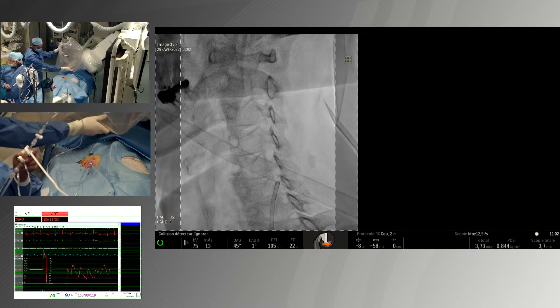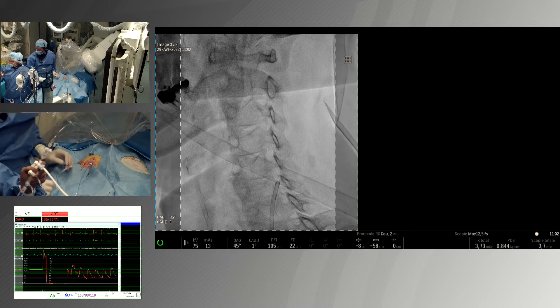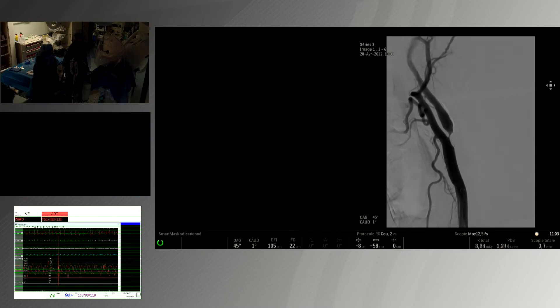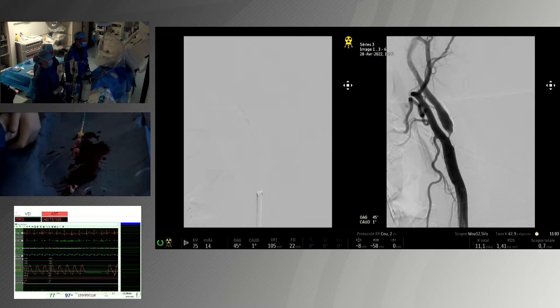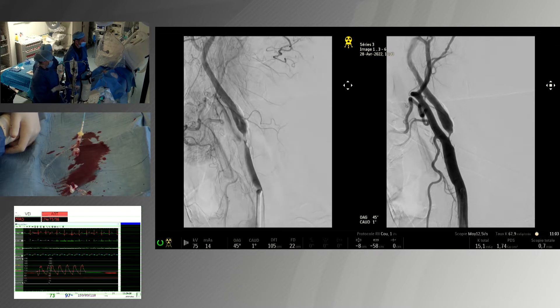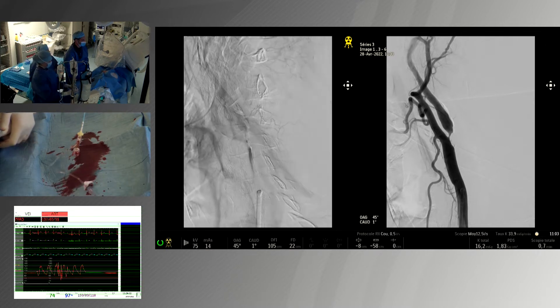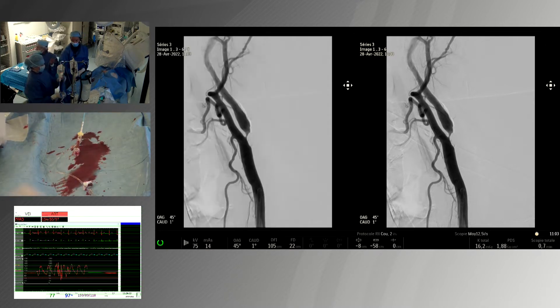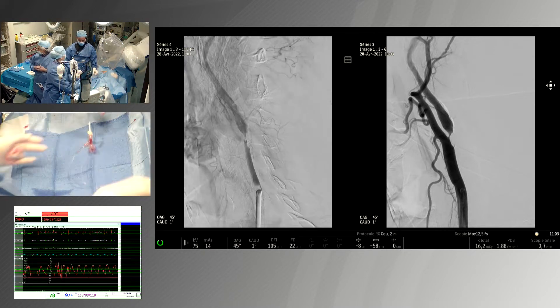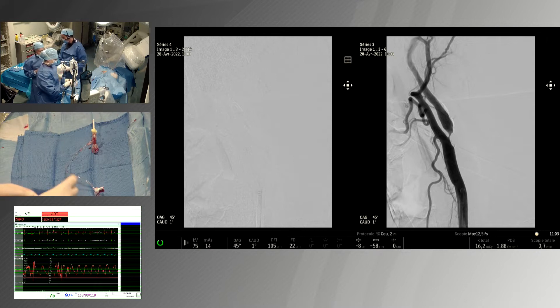We have installed the manual system and we are going to check the lesion now. You can see it's a very severe stenosis with a small niche inside — it is an ulcerated lesion. This makes it a very high risk lesion.